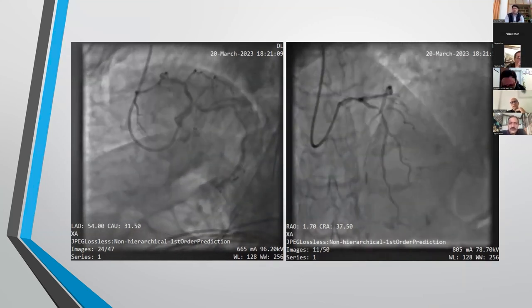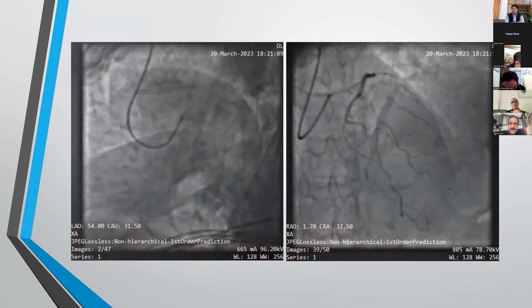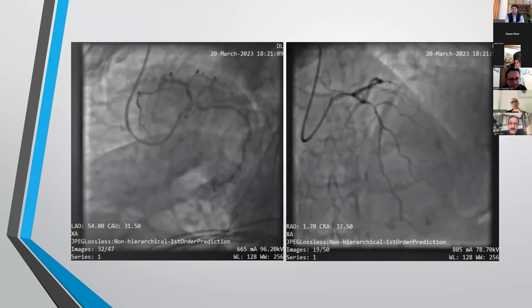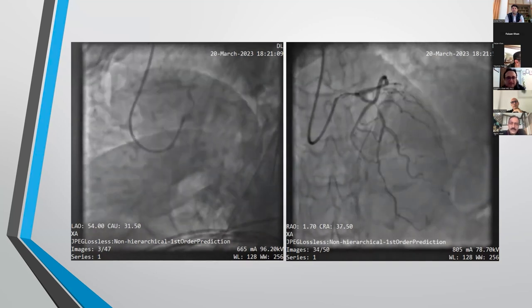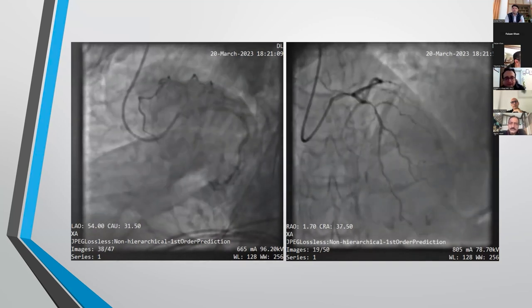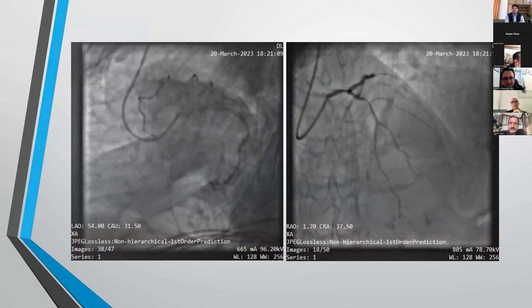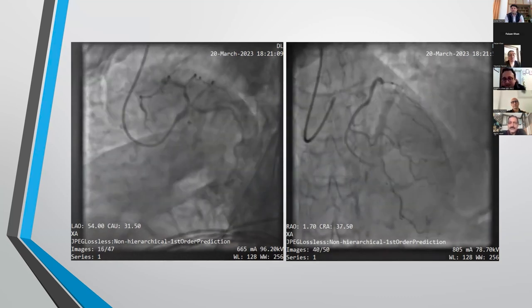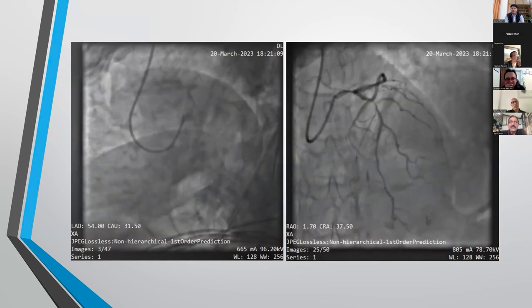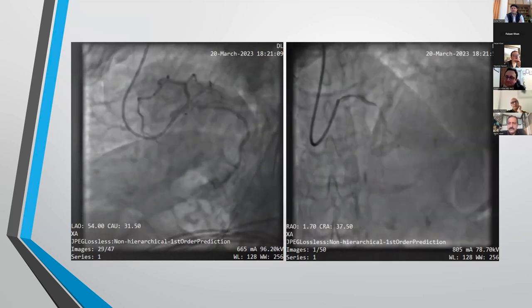left main के साथ. For you, Asad, so you always evaluate left main with IVUS, don't use FFR, IFR for evaluation. For something like this, like for I don't know, ये शायद इनको सस्ते मिलते हैं FFR वाले wires, हमें तो एक ही प्राइस की मिलती है. तो for me, I would have done an IVUS. Generally for left main lesions, I do an IVUS.